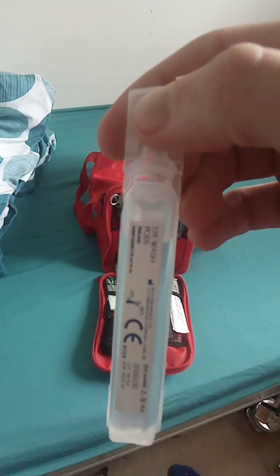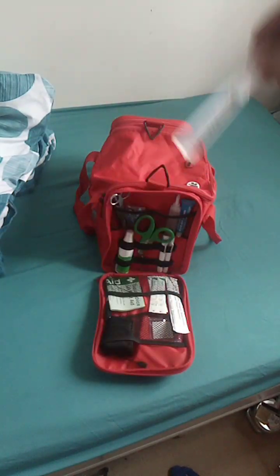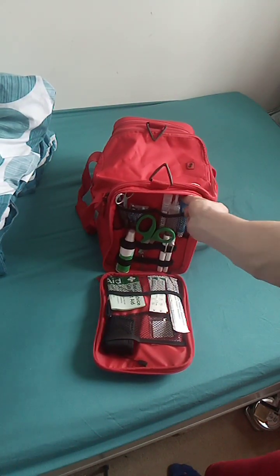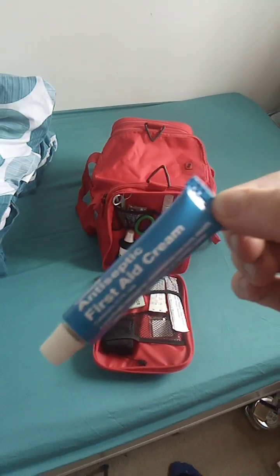Saline solution, eye wash pods - for irrigation of wounds and eyes. And 15 grams of antiseptic first aid cream. And that is that pocket.